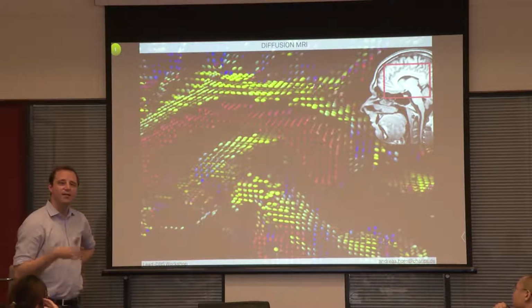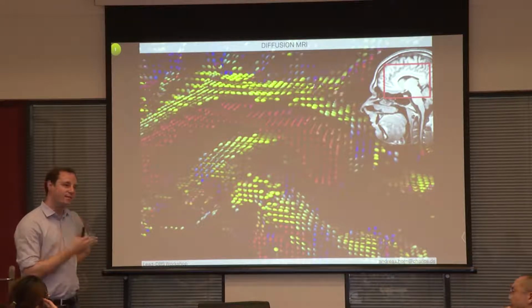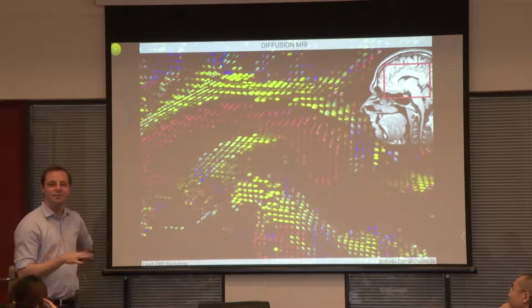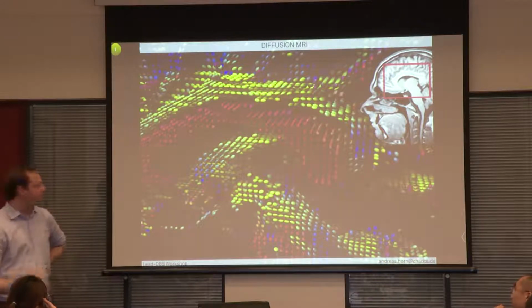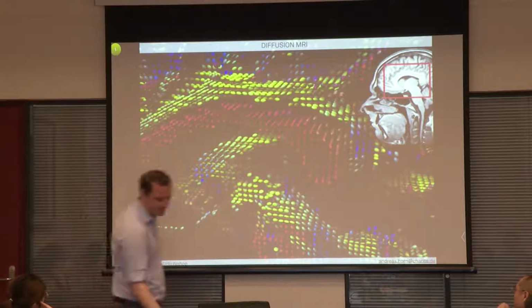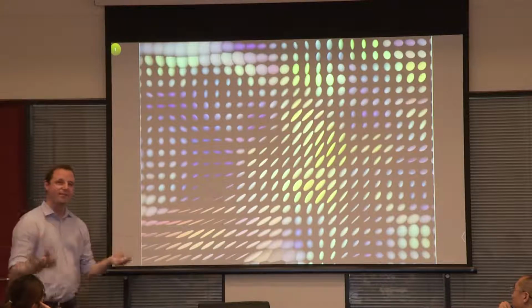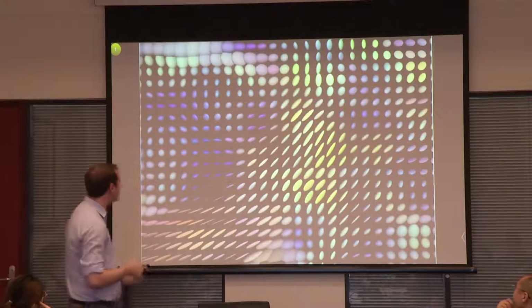But every time you use tractography, it's not magic, but it's basically a very indirect measure of water diffusion. And it has a lot of limitations, so you should never forget that. It's really a very, very indirect measure. But it's still the only one to do it without opening the skull and cutting things.